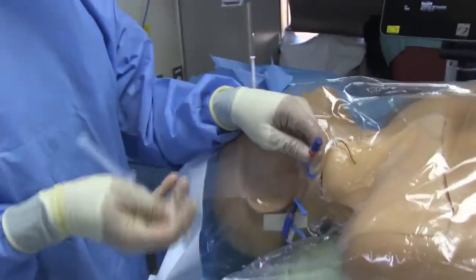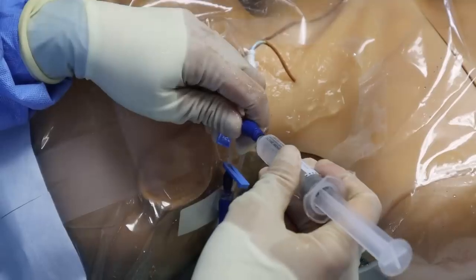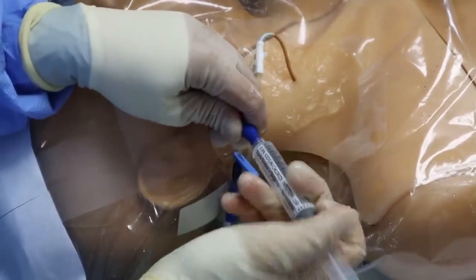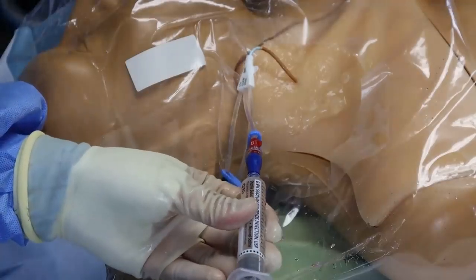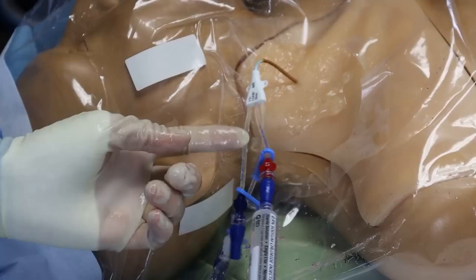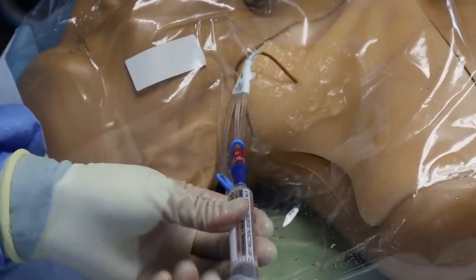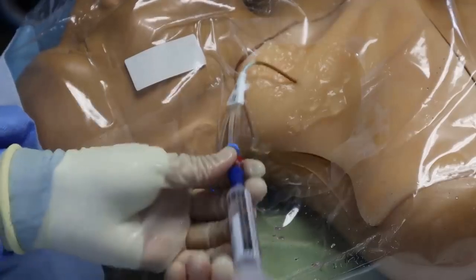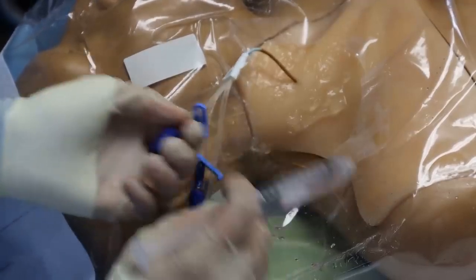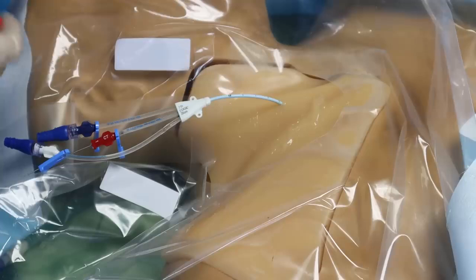We now need to draw back from and then flush each of the three ports. Take the sterile saline syringe and attach it to one of the ports. Aspirate from the syringe just enough until you see red appear in the line tubing. Don't pull back so far that blood begins to enter the syringe. When you see red begin to enter that tubing, push the plunger and flush a little bit of that saline through the line. And now do the same thing for the remaining two ports.